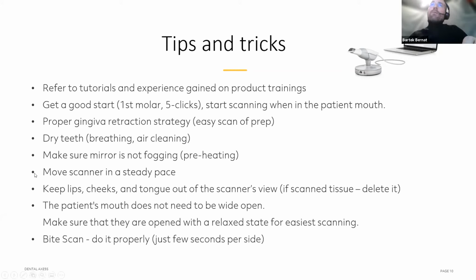Okay. Very important part is also to move the scanner in the steady pace. Try to avoid jerky movements, and then you're going to have stable results. So moving a scanner in a steady pace is even more important than moving fast for a start.